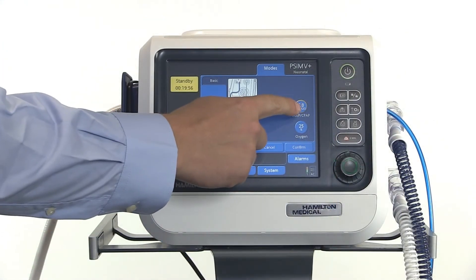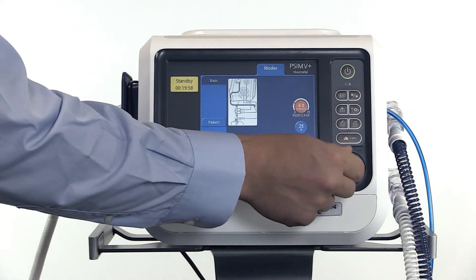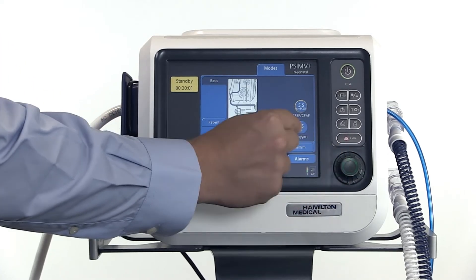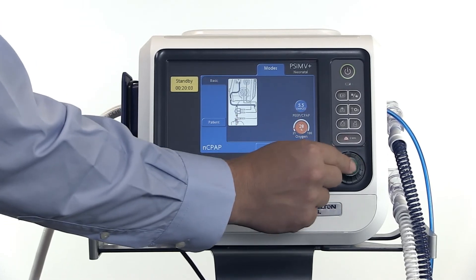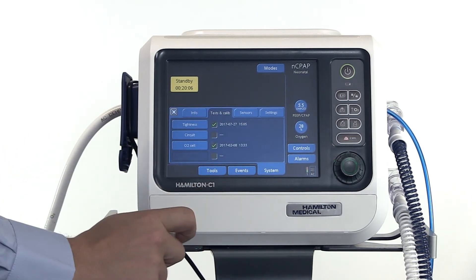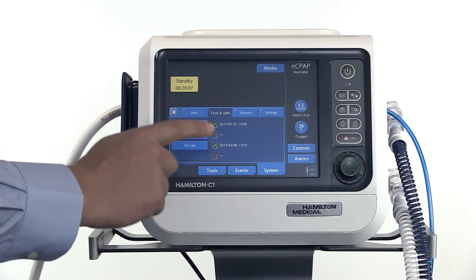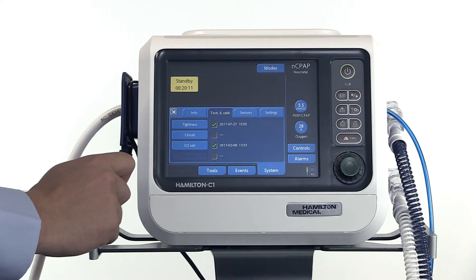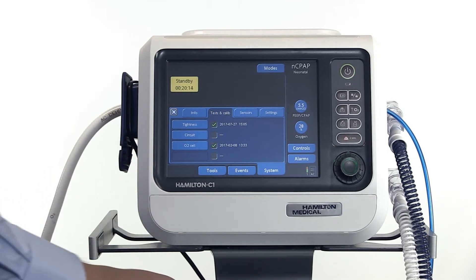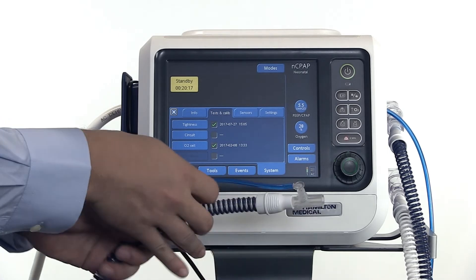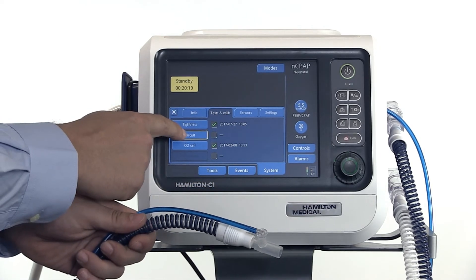Now check the default settings for PEEP, C-PAP, and oxygen, and adjust them if necessary. Save your adjustments with confirm. The pre-op check window opens automatically. For optimal tube resistance compensation, you need to calibrate the circuit — simply follow the instructions on the screen.